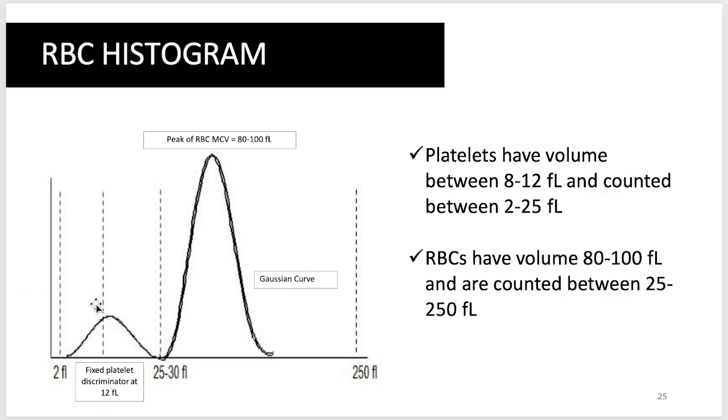A platelet size distribution plot is produced using a 3 threshold. So, ito yung 3 threshold natin tatandaan. One fixed at the 12 femtoliter and the other 2 are allowed to hunt the upper and lower ends of your platelet population between certain limits. The lower platelet size threshold may move between 2 and 6 femtoliter, the higher between 12 and 30 femtoliter.